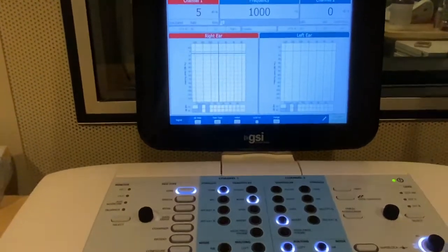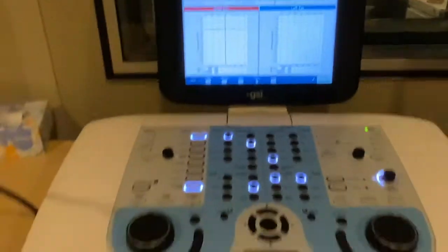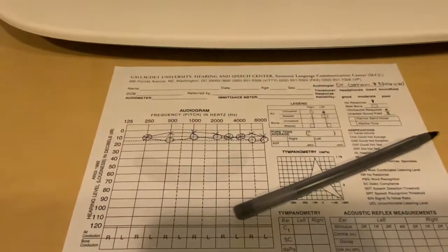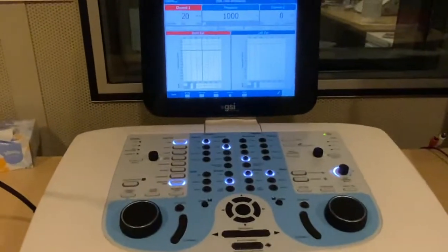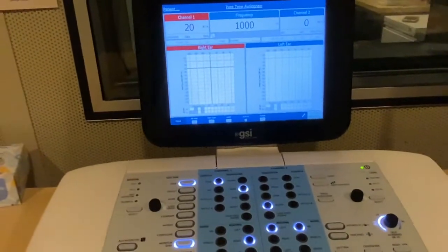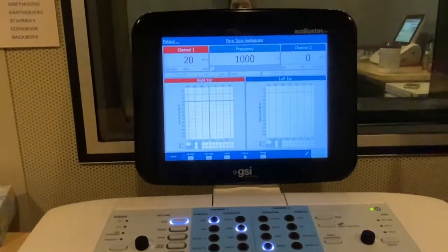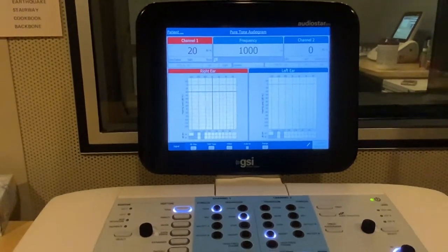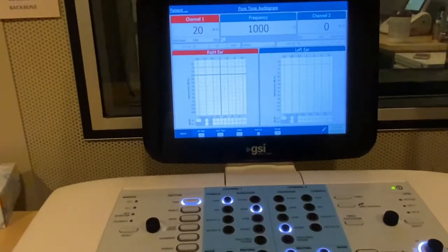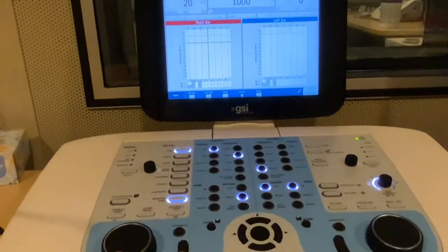And again, we're going to want to set it first at an audible level. And since we already got air conduction thresholds for Emily at 1,000, around 10 to 5 dB, how about we start just a bit above that? We'll start at 20 to make sure she can hear it, but not at a too loud level that will make it feel like it's vibrating on her skin. We want it to actually be heard rather than felt. So we'll start at 20 and we will present it.